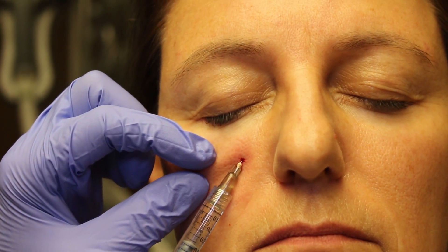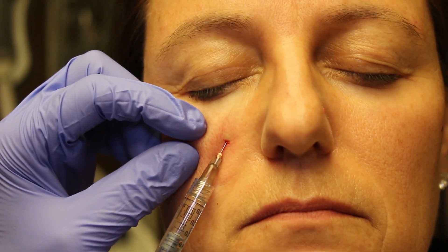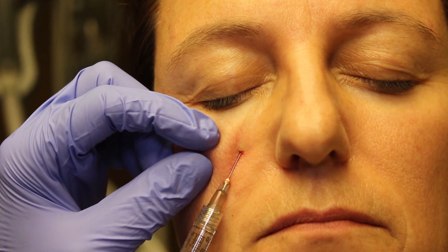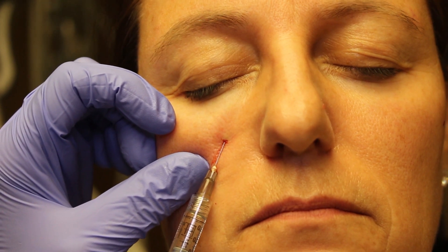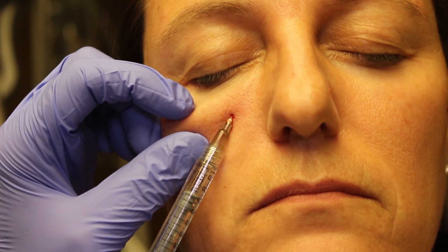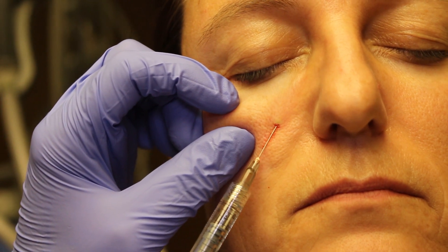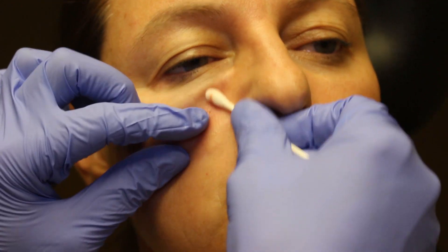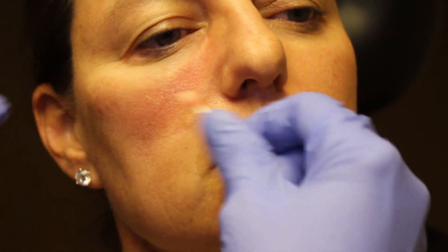So we're going to come in just a little bit more. Less is more. Slowly, slowly — this should not hurt, you should not feel any pain with this at all. Here we are right at the tip. Just a little retrograde injection, and that's all we need. I'm going to smooth that out by rolling the cotton tip applicator. And there's our product — so that will lay down just beautifully right in that groove. That looks so good.